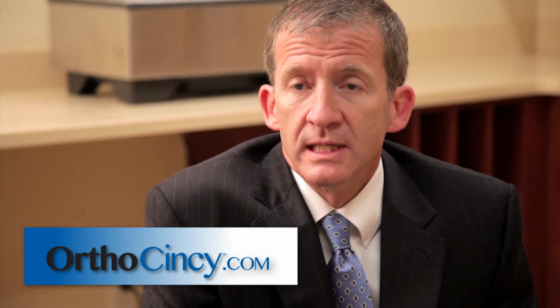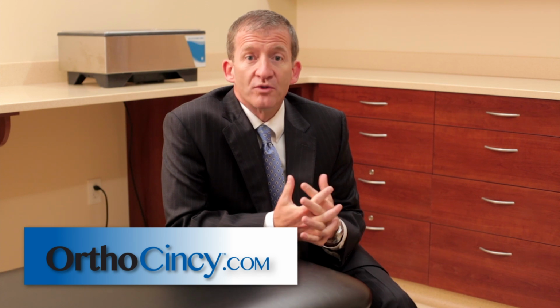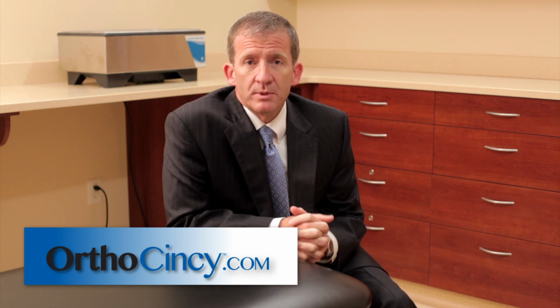Arthroscopic surgery, simply put, is making small incisions on the front or the back of the joint, in this case the ankle joint, to place a camera inside that joint and then use another small incision to place instruments inside that joint to gain access for both diagnostic and treatment purposes.